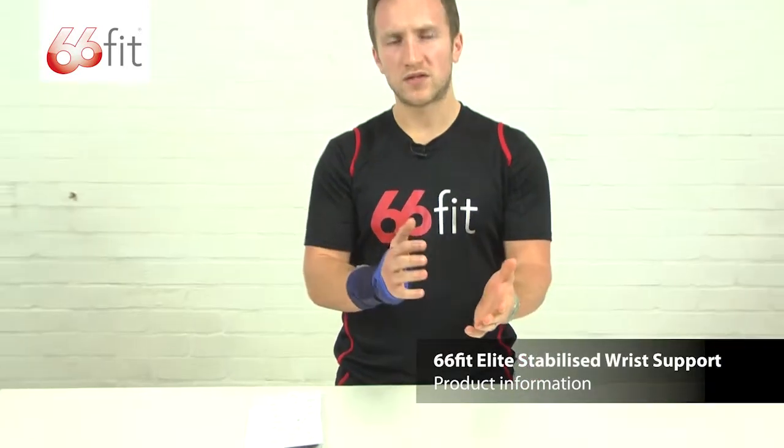I'm now going to show you in a bit more depth one of those supports. This is the 66 Fit Elite stabilised wrist support. It's made of 100% breathable neoprene inner core with a 100% nylon outer layer. There's also a metal brace that runs down here for the inside of your wrist and down towards the palm of your hand. That can be removed and taken out if you wish to wash it.